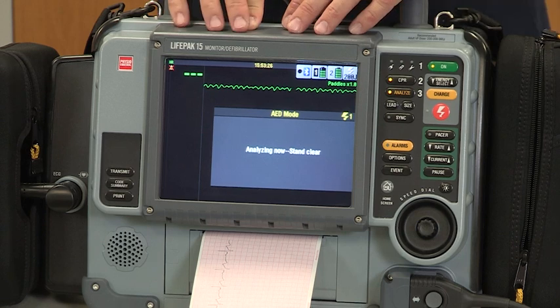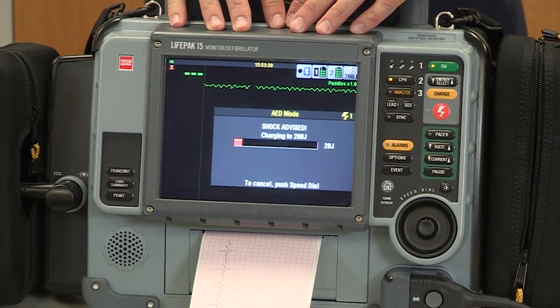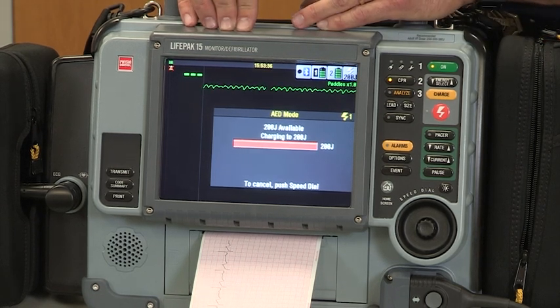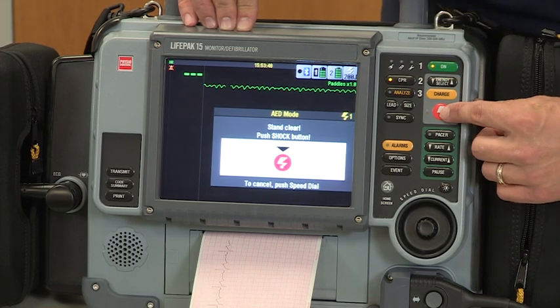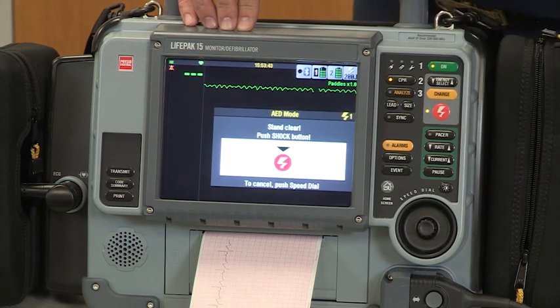Analyzing now. Stand clear. Shock advised. Stand clear. Push shock button.